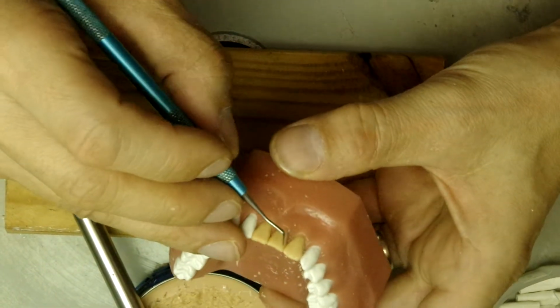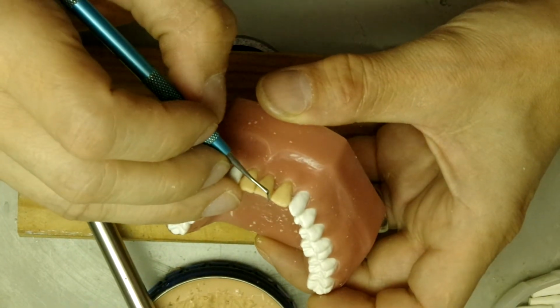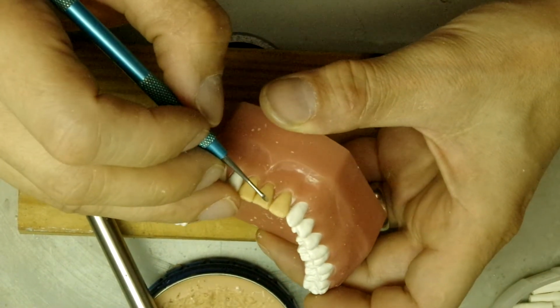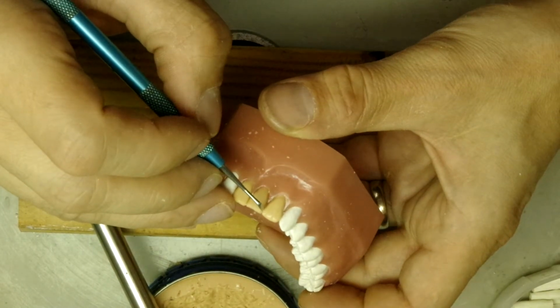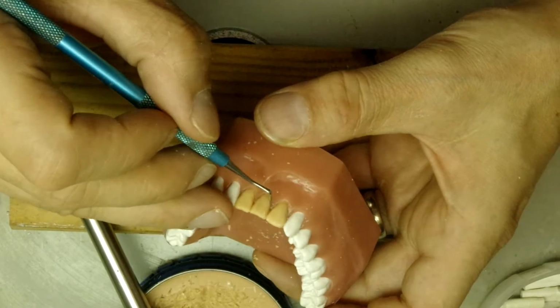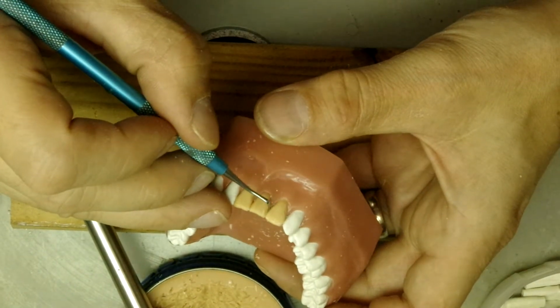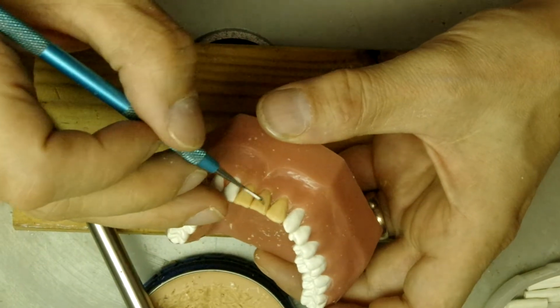So here we don't have enough of an incisal embrasure, and the contact area is a little bit too high, so I'm going to lower that a little bit by making more of a convexity in the interproximal of the lateral incisor.